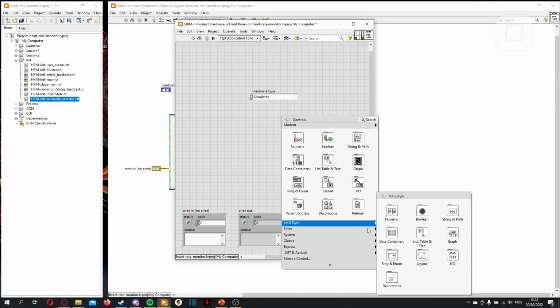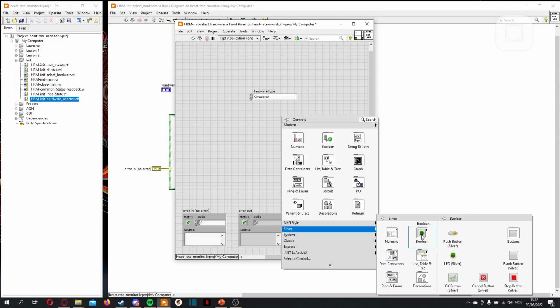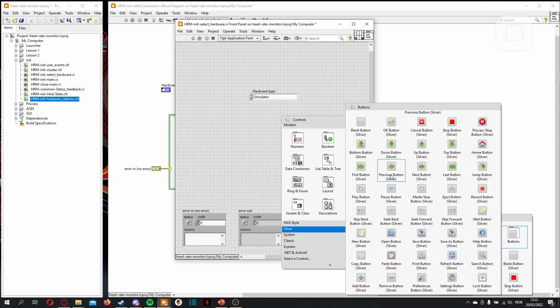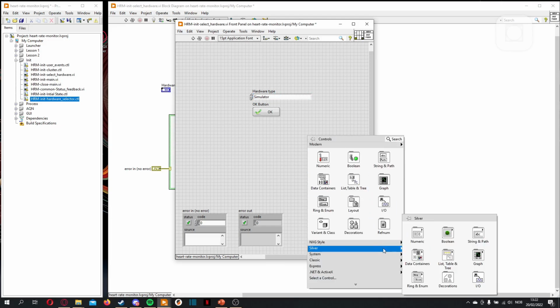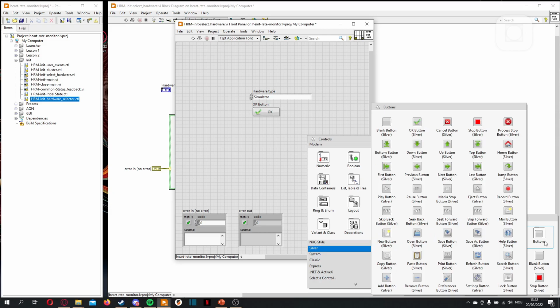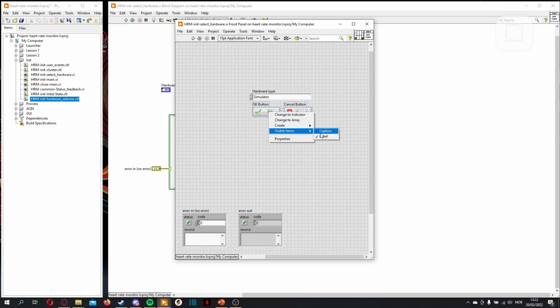I'm going to use silver just to show you a few other buttons. I guess the best thing is to be consistent, but that's fine. So let's take the OK button. And then let's find the cancel button. There's no difference between the buttons I choose. It's just the visual. But when they already made the visual part, why do anything about it? It's nice that some work has been done for you. We don't need their labels as they are obvious. And then we can make the GUI a little bit smaller.